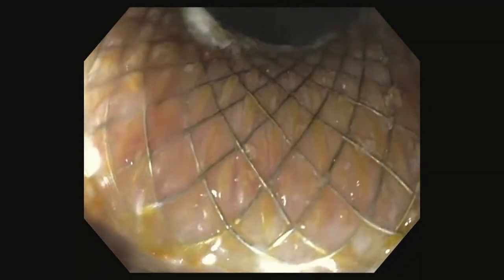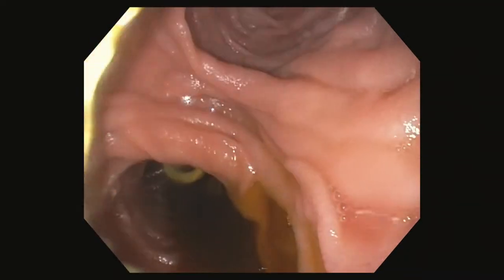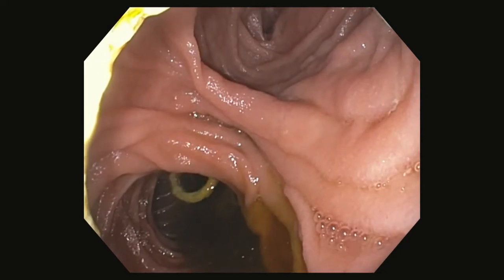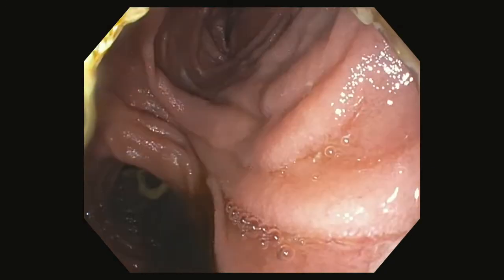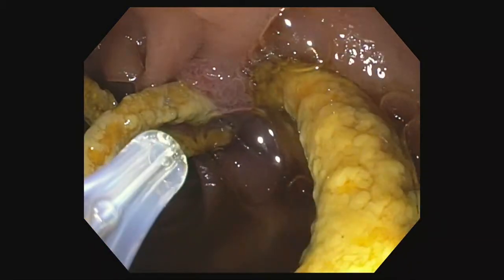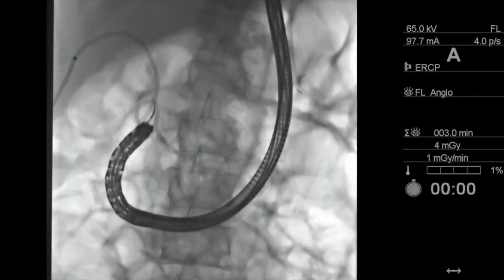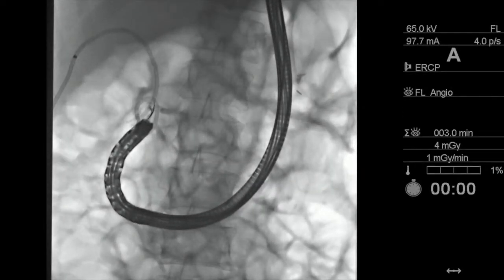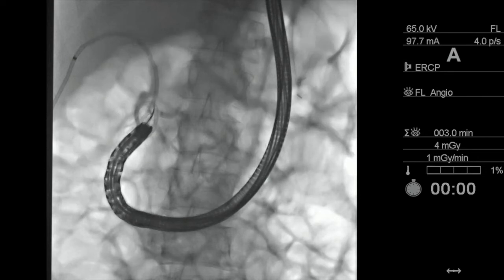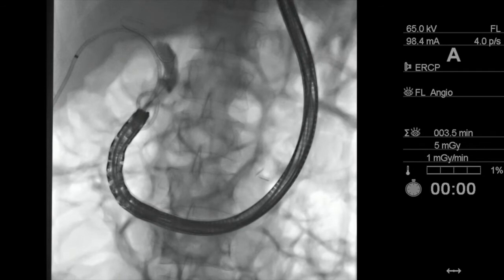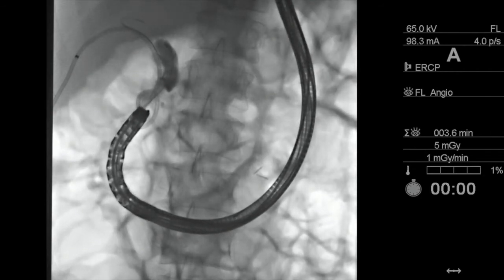The 10 French double pigtail plastic stent was removed and the duodenoscope was exchanged for a therapeutic gastroscope. The therapeutic gastroscope was advanced through the lumen-apposing metal stent, and a partially clogged biliary drain was identified approximately 7 centimeters distal from the lumen-apposing metal stent. The gastroscope was advanced retrograde towards the ampulla. The pancreatic duct was inadvertently wire cannulated given the percutaneous biliary drain was in place. Contrast was injected to confirm location of the pancreatic duct, and the bile duct was deeply cannulated.